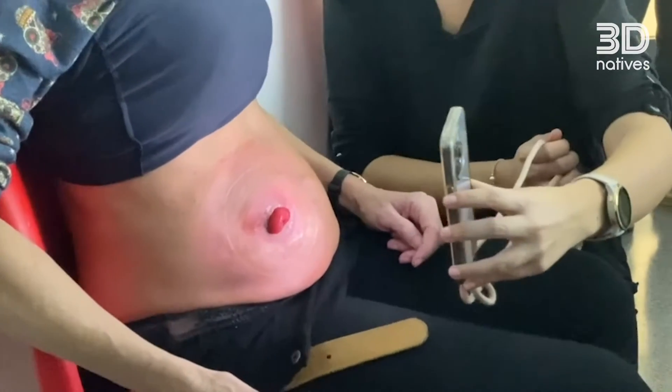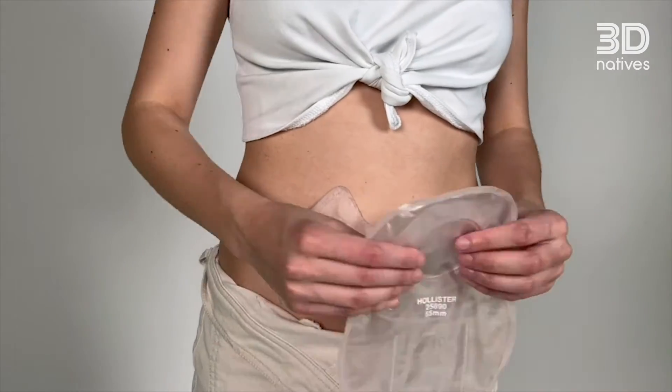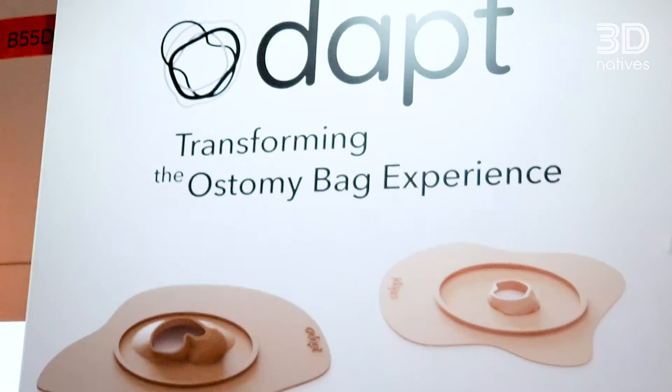The idea of ODAPT started a few years ago when I actually met a person that just had a leak with an ostomy bag. Identifying this problem, I then had the opportunity to do a project at university, where I met Jessica and Patricia and where we really started developing this idea.